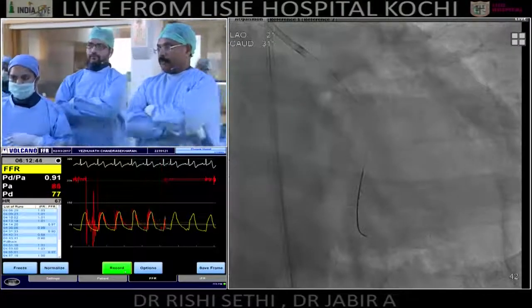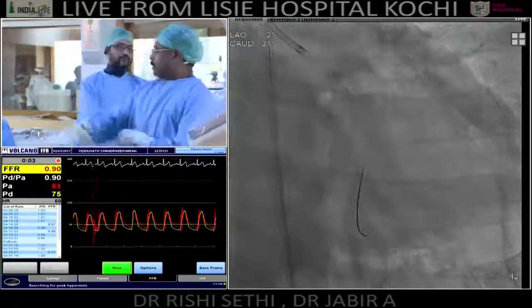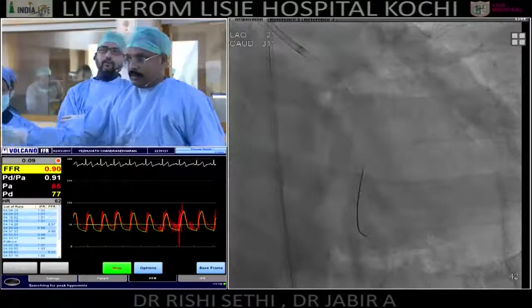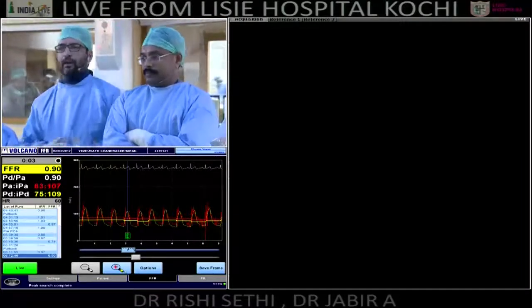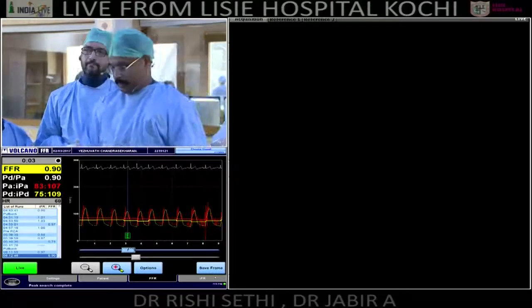The other thing is the advantage that IFR gives. You mentioned tandem lesions, and we're working at Imperial on co-registering these images. So I'll have a couple of cases tomorrow that I can share with the group. Great case. Thank you very much. Wonderful. So great to hear from Dr. Sen, who is the pioneer. Yes. FFR is 0.9 now. Yeah, that's good.